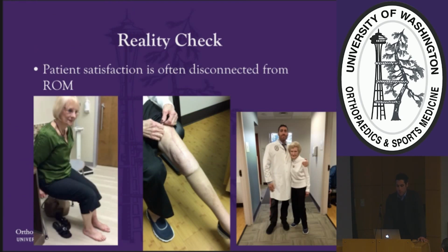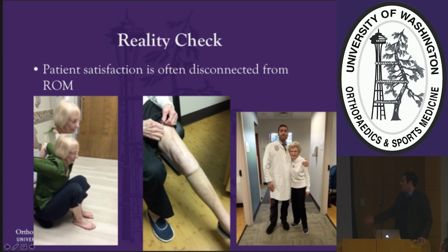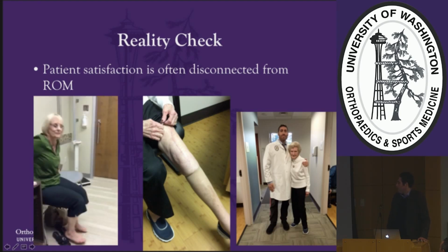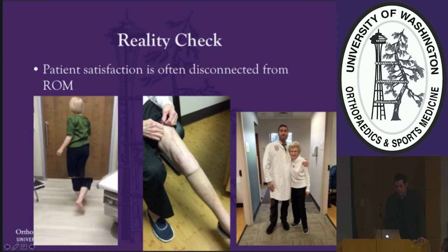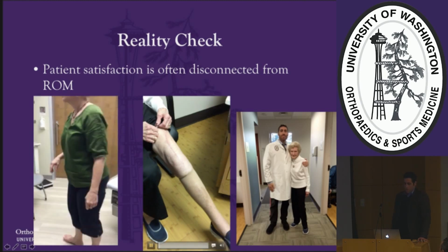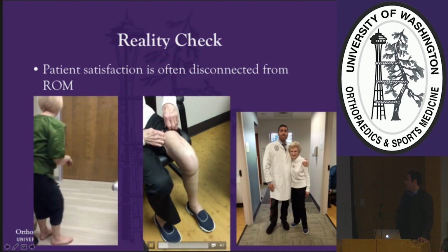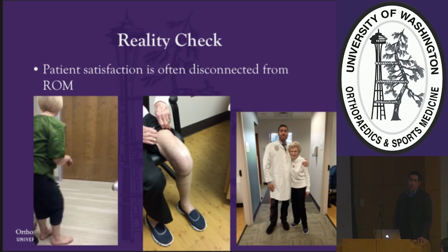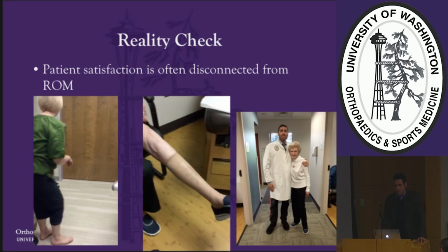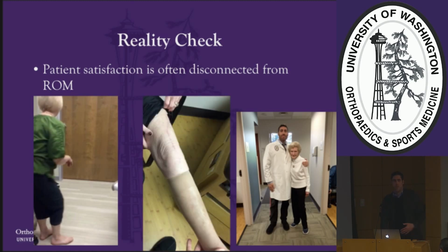And so the other thing I would submit is that patient satisfaction is often disconnected from range of motion. So, here's a lady that wanted to get back to yoga after a total knee. She's got great range of motion. She's very satisfied with her range of motion. Here's a 90-year-old that had a revision surgery who has much more limited range of motion, but she is also extremely happy with her knee, given her circumstances and her functional level. So I think that, again, this is where raw data wouldn't really tell us what's going on with these patients.